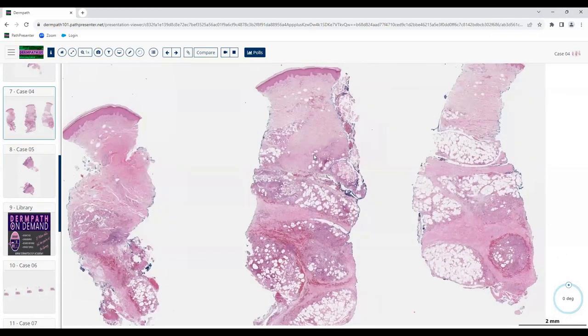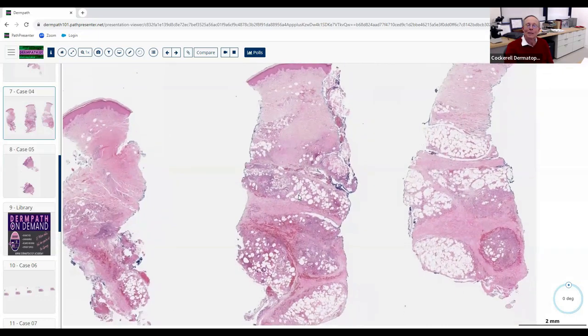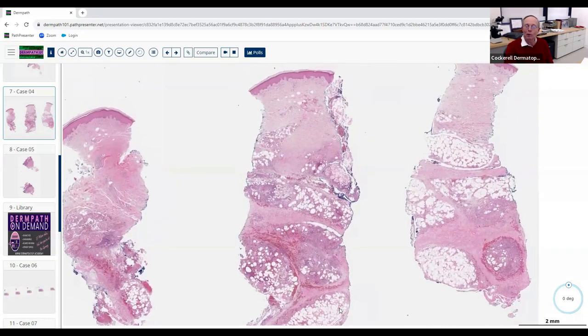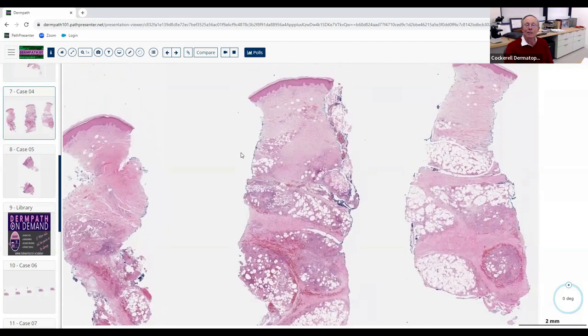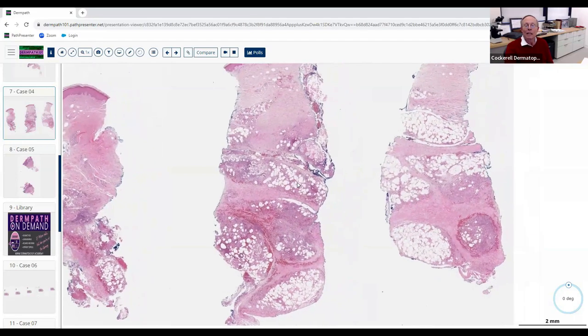Next case — it's a punch biopsy. On scanning, the pathology is more in the subcutis — actually it's almost entirely subcutaneous. This is a lovely, very deep biopsy — whoever did this probably buried the punch all the way down to the plastic. This is where the dermis ends and the subcutaneous fat and fascia begin. The pathology is in the fat.